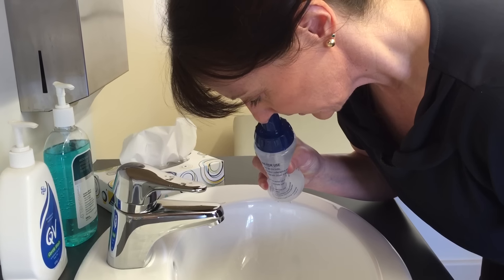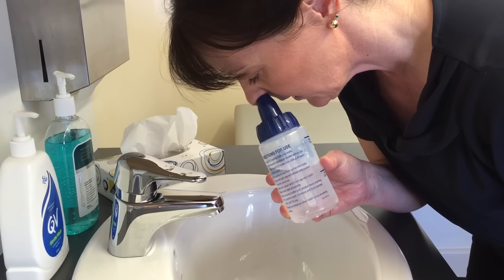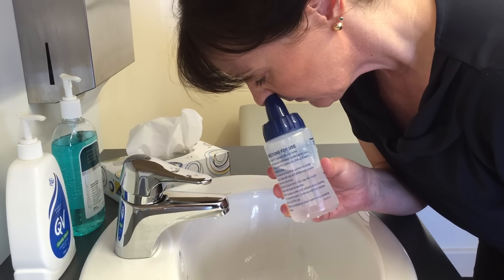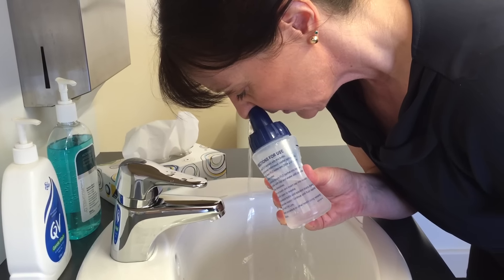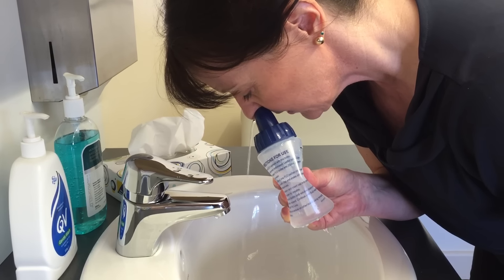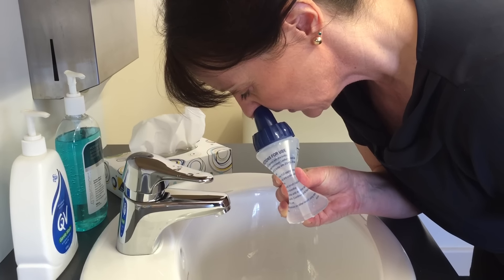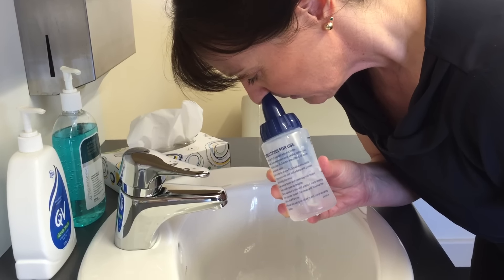Squeeze half the bottle into one nostril, then take the bottle across to the other side. Allow it to refill with air and then squeeze again. Once the bottle is empty, you can blow your nose.